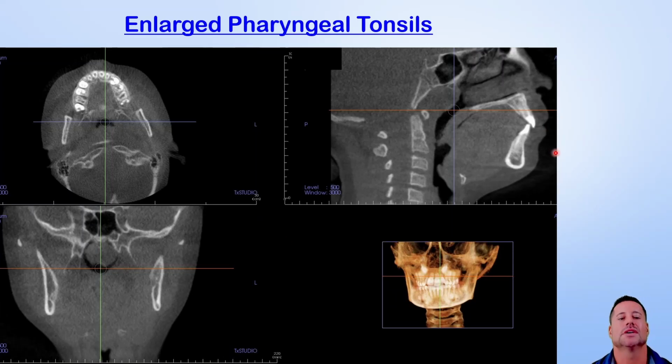And then also you'll notice a lot of these patients have that upward head tilt, right? And people say, oh, you can't diagnose anything on airway with a 3D because head posture is variable. Sure, it is variable, but sometimes the variability actually helps you understand what's going on. When patients are constantly like this, a lot of times it's to try to get patency of the airway, just like we do with a head tilt in CPR. But regardless of the head posture, there's the adenoids.